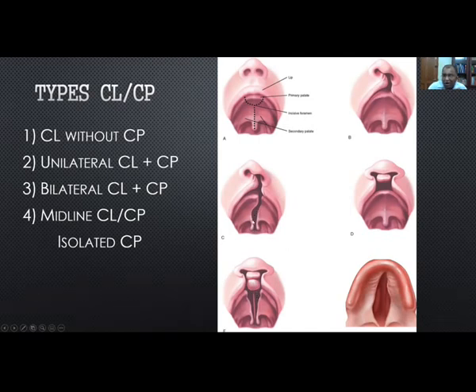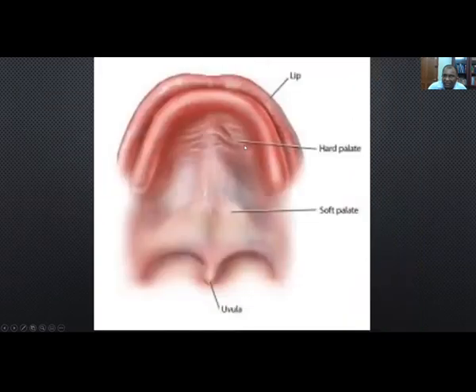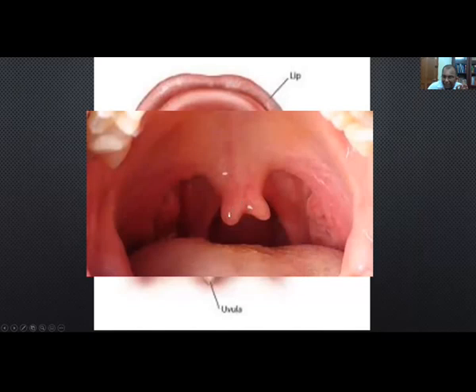Posterior palate clefts always happen in the midline. As you can see, posterior palate clefts always happen in the midline. Whether it's a complete cleft or an isolated soft palate cleft, they are always in the midline. And that's the embryological significance of the incisive foramen. This is because, embryologically, the palate closes like a zipper from the incisive foramen posteriorly towards the uvula. It goes anterior to posterior. It closes this way. And so the mildest form of a cleft is a bifid uvula.